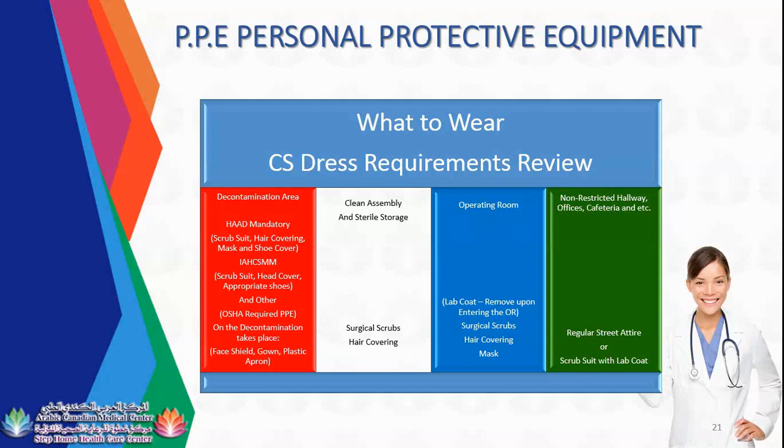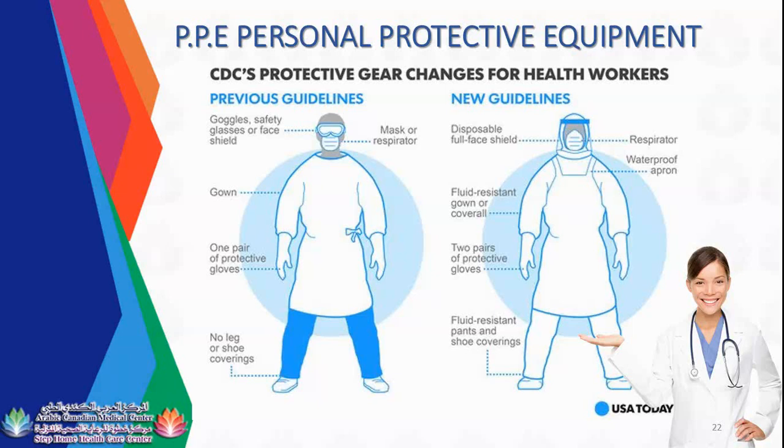Previously, this is the guidelines of CDC, and in terms of PPE, before you have the option, if you have their face shield, goggles, just face shield and goggles, actually safety goggles, if not. So now, the new guidelines, you need to wear face shield, disposable full face shield. If you are using reusable, by the way, you need to disinfect it daily. So previously, it is your mask or respirator. Now, it is respirator.